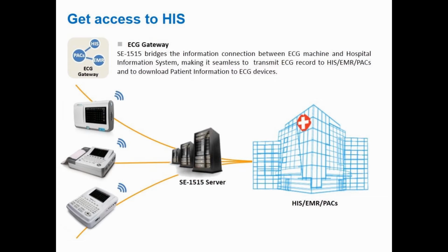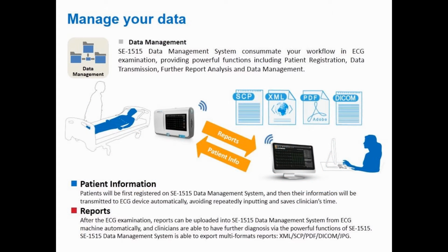As a network gateway, SE 1515 bridges a solid bidirectional communication between your EDAN ECG machines and information system, making it easy to transmit the ECG record to EMR, PACS, and to download patient information to ECG devices.